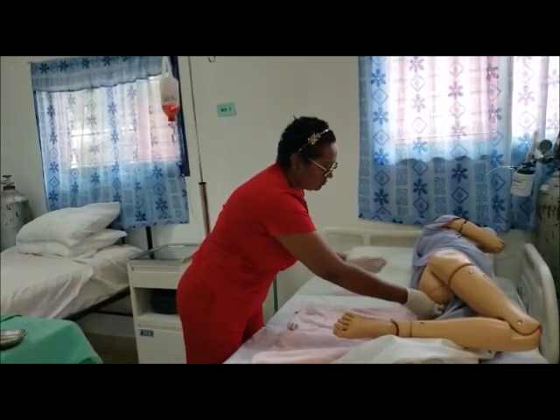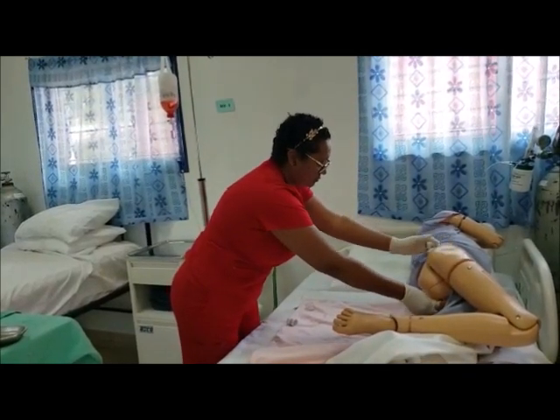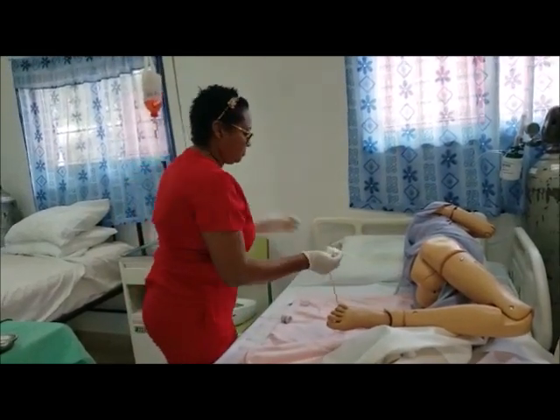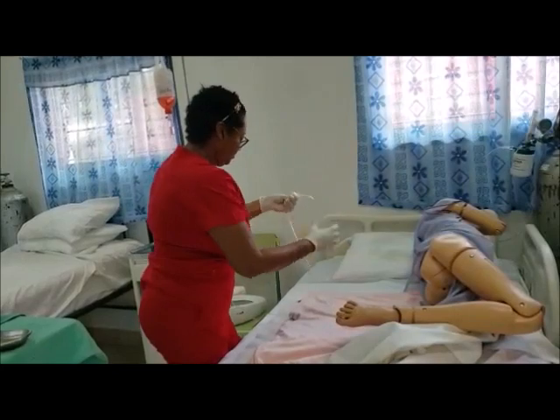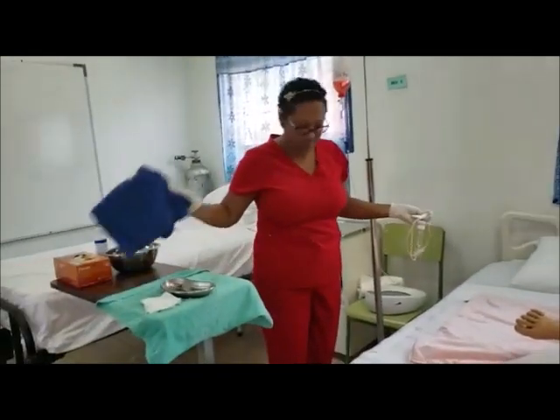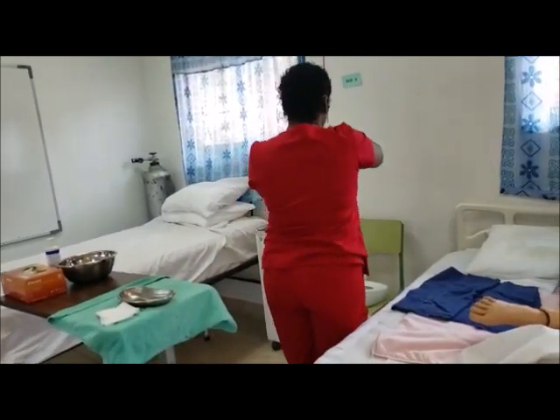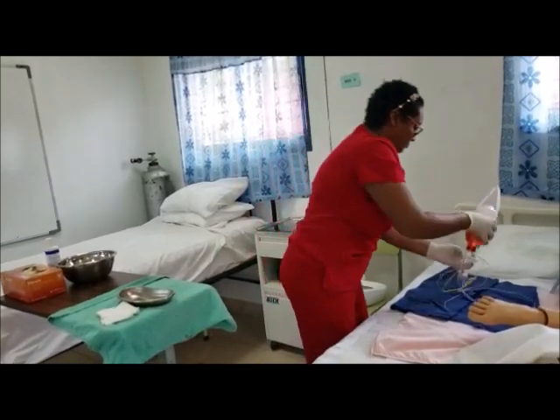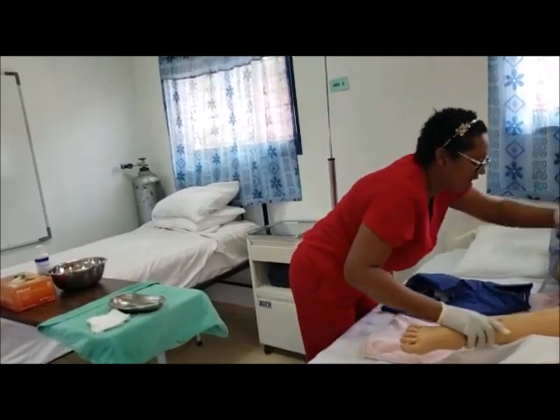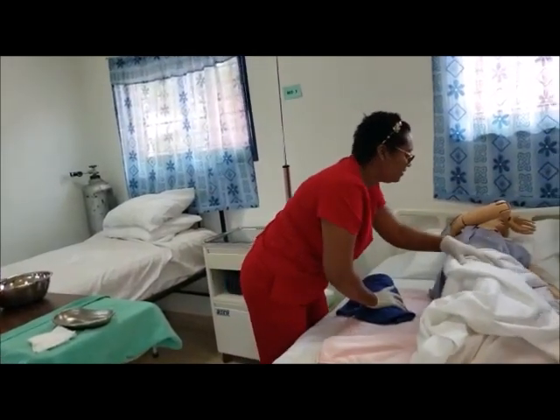After all the solution has been instilled, or the client cannot hold it anymore, close the clamp. Okay, thank you. Remove the enema tube from the anus and place it in a disposable towel as it is withdrawn. Encourage the client to retain the enema 5 to 10 minutes, or 30 minutes for retention enema. Okay, sir. Fix your leg now. Do not move for 5 to 10 minutes.